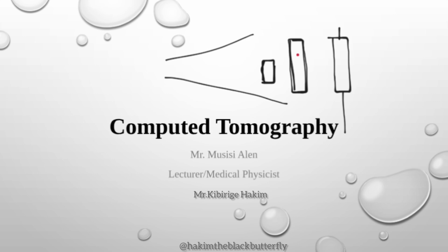That's how CT produces images, as if it got a knife and started cutting slices of anatomy. The structures are not overlapping each other. You see them independently in those slices.